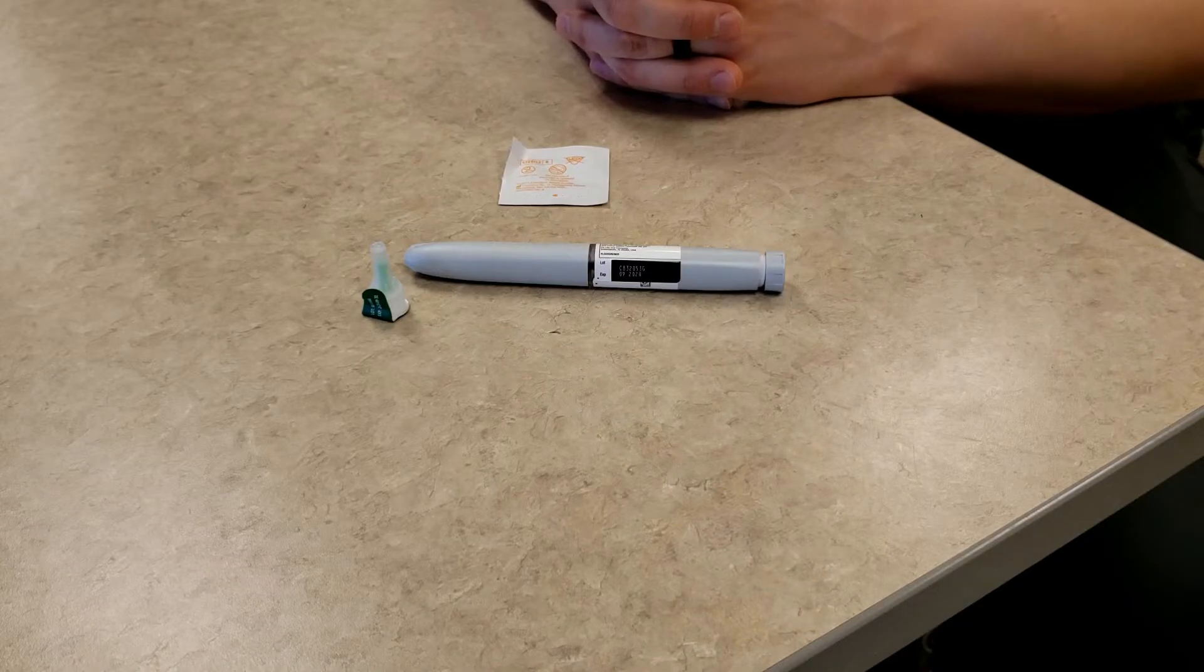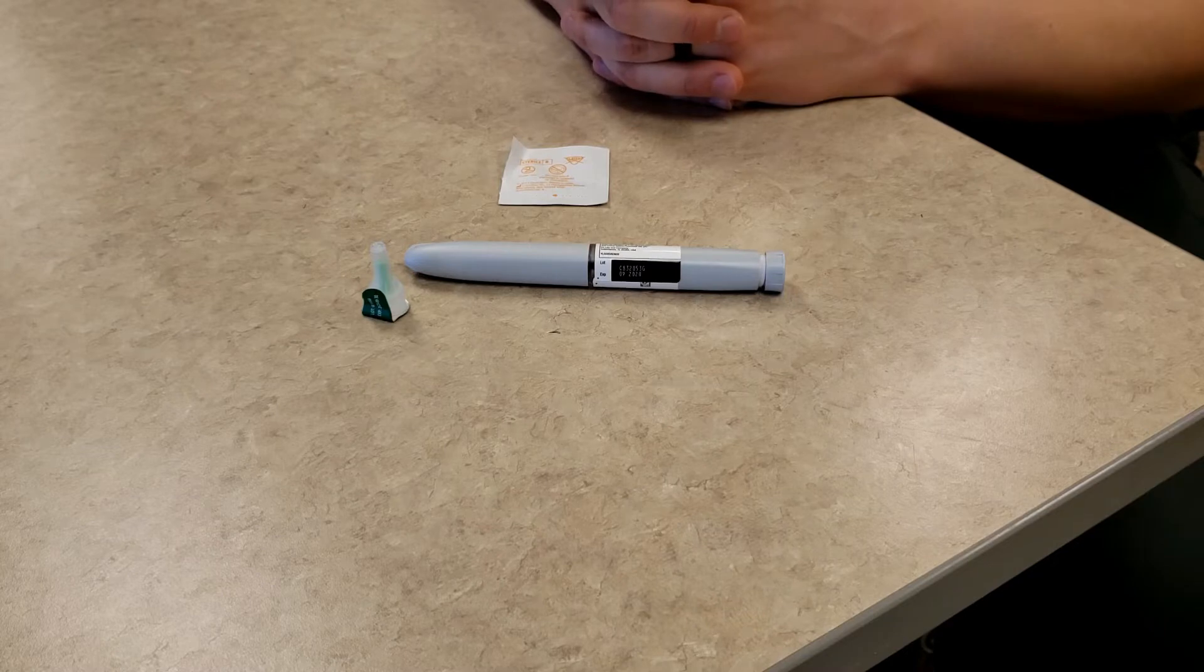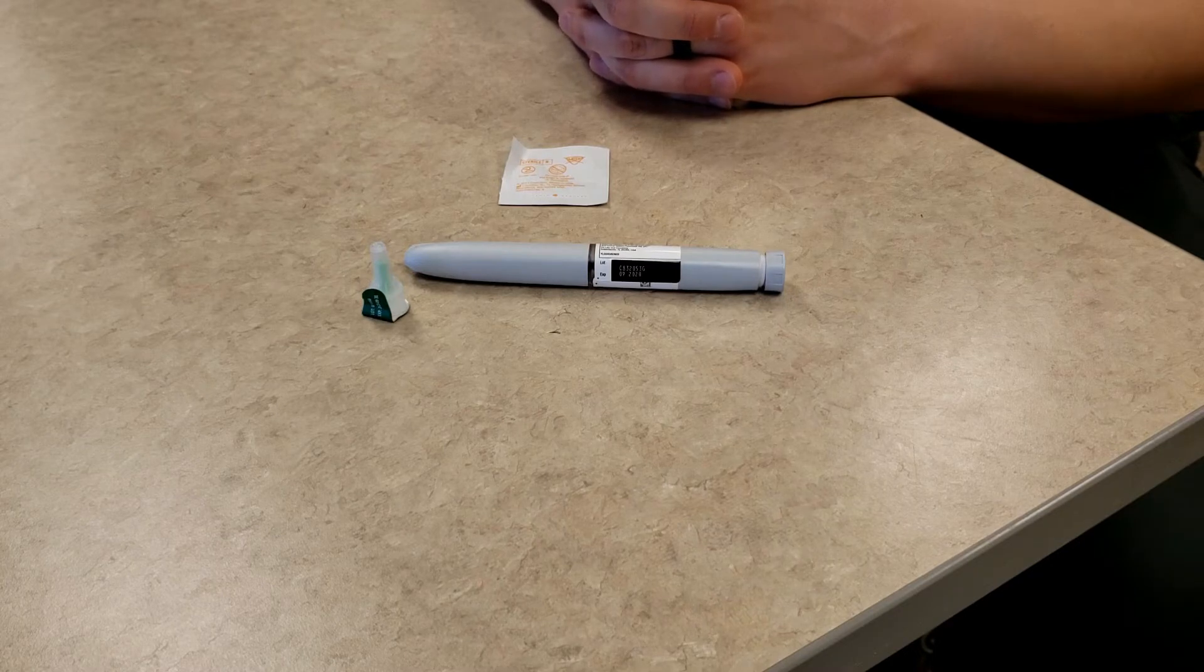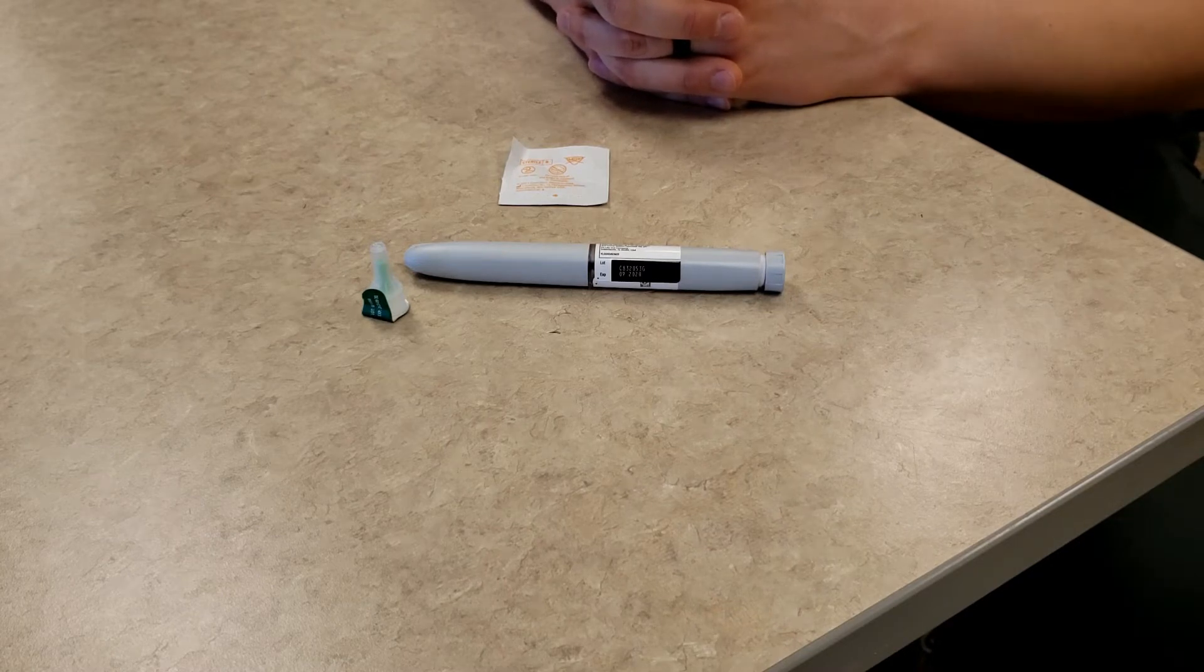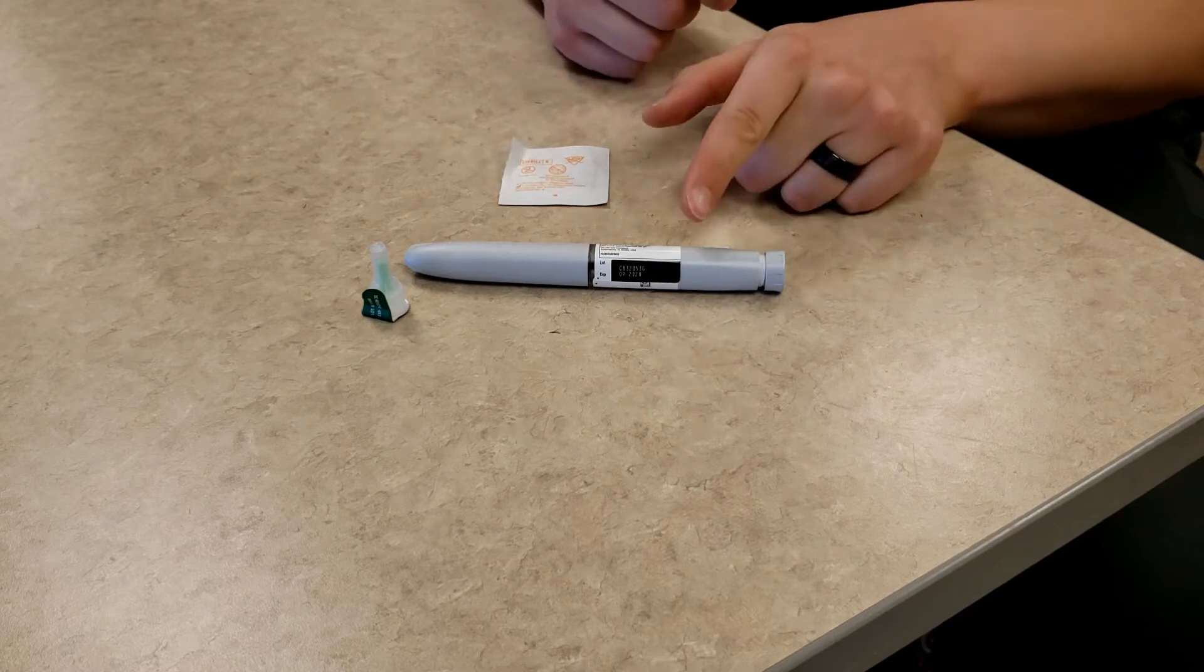Once you have the correct supplies and you have washed your hands, you can get started. For this demonstration, I am going to measure and inject 14 units of insulin.